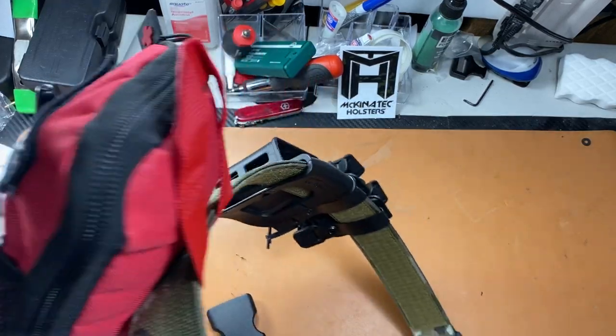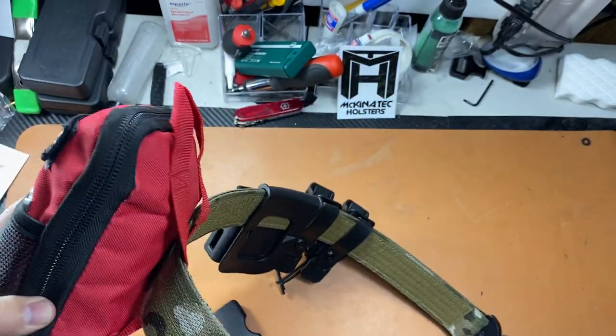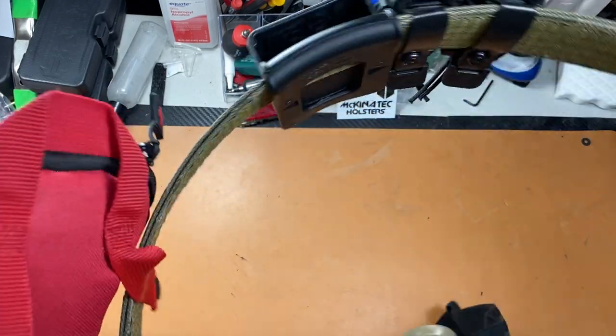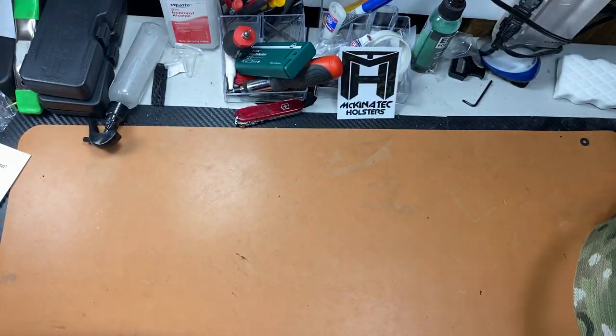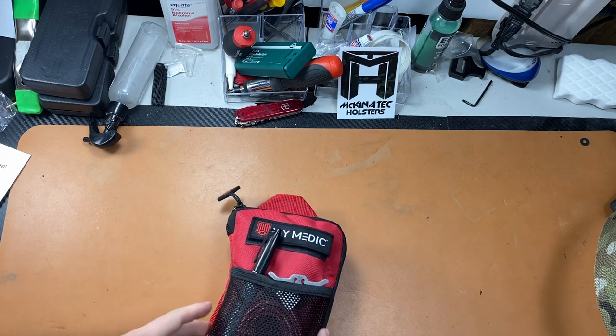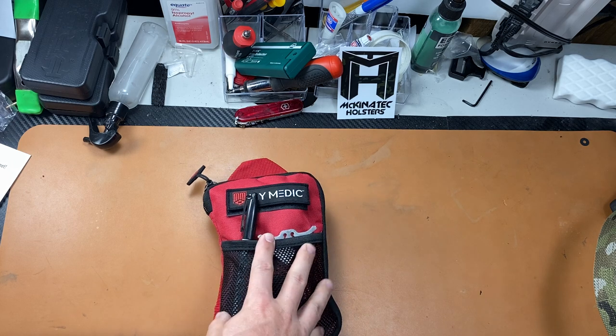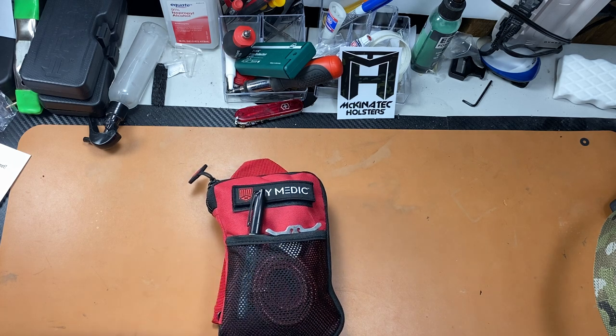If you've been asking about the med kit I run on my range belt, I wanted to show you today. This is the My Medic personal first aid kit — they call it the Solo. It comes in a bunch of different pouch colors, and I've added a few things we'll go over, along with what comes in the basic kit.